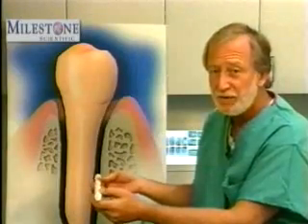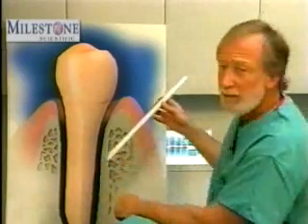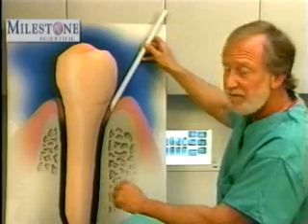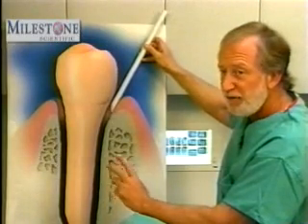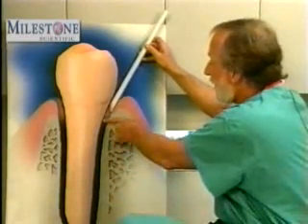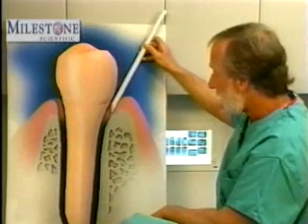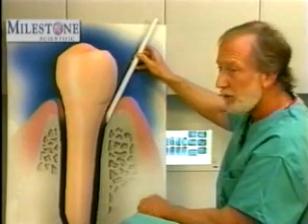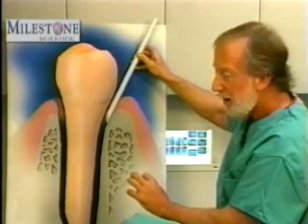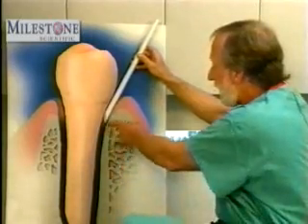The anesthetic squirts into the patient's mouth as I'm depositing it. Two possible problems here. The first and more likely is that you have not advanced the needle far enough into the PDL. A seal is not being formed, and the path of least resistance is for the anesthetic to simply diffuse back into the oral cavity. The second possibility is you're in far enough, but you don't maintain a downwards pressure on the needle throughout the injection. Again, that breaks the seal, allowing the anesthetic to diffuse back into the patient's mouth.